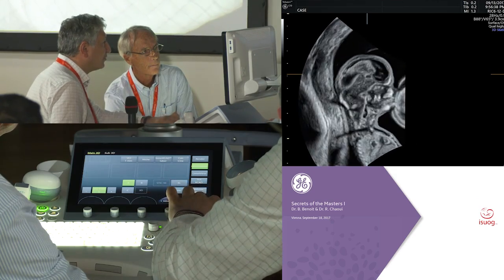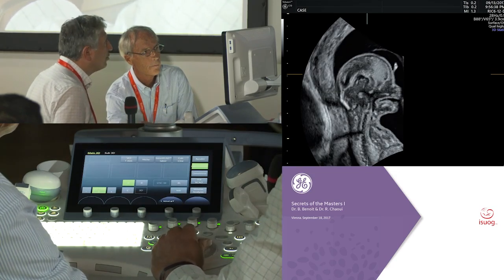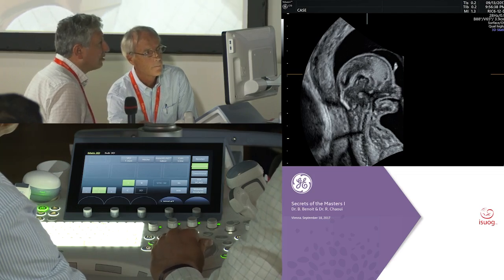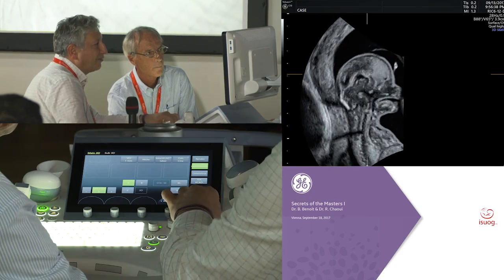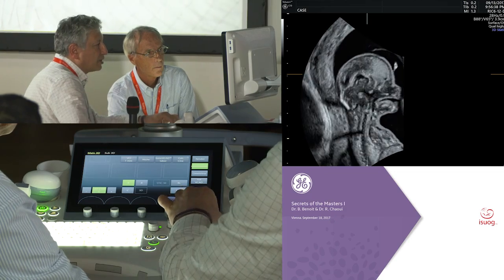By scrolling left and right, you see here that the posterior part of the brain is abnormal. The brain stem is thickened. There is no intracranial translucency. And you see this is, let's say, the direct volume acquisition and demonstration, so you can believe what's going on.